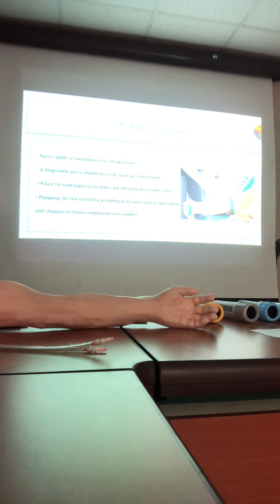The black one can hit the skin and injure it, it is very fragile. For pediatrics there is a special small rubber, single use only. You can order it from the system from the store.